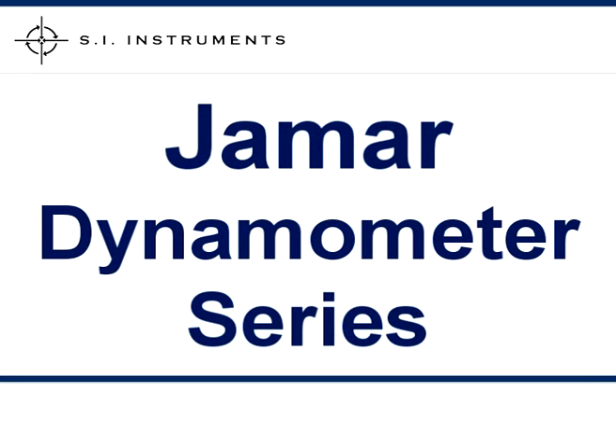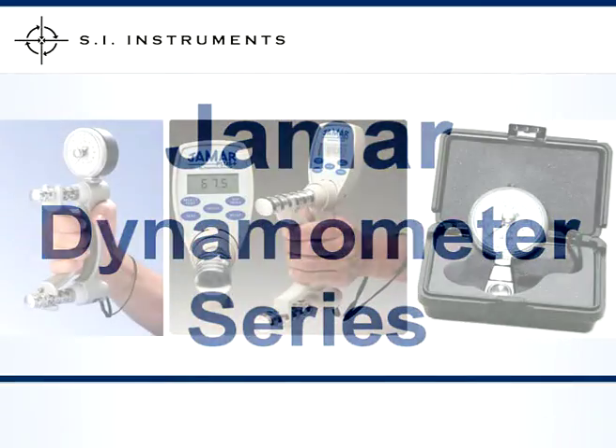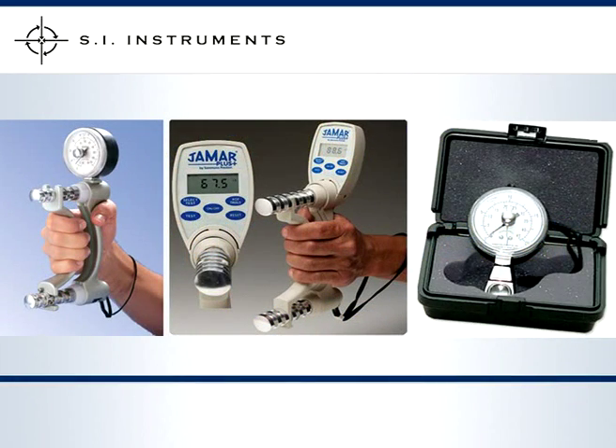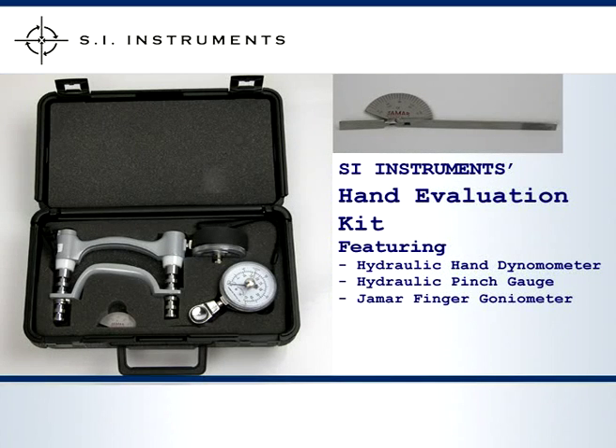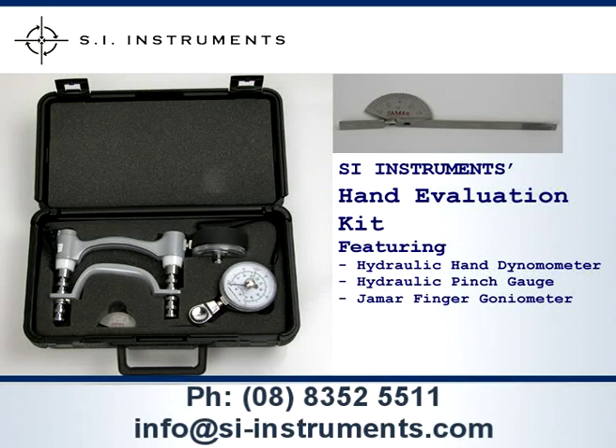The Jamar Hydraulic Dynamometer, the Jamar Plus and the Jamar Hydraulic Pinch Gauge are sold separately and come in a robust carrying case with a certificate of calibration and operating manual. Alternatively, SI Instruments provides the hand evaluation kit which includes the Hydraulic Dynamometer, the Hydraulic Pinch Gauge and Jamar Finger Goniometer, which allows easy range of motion measurements to be made.